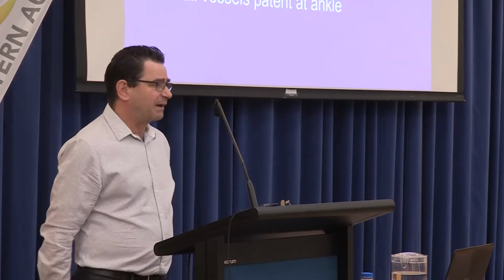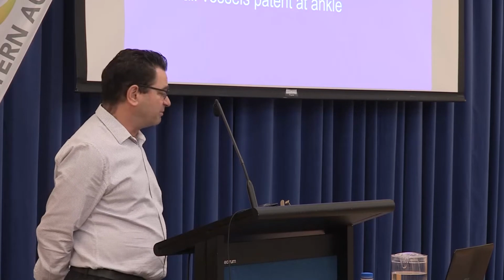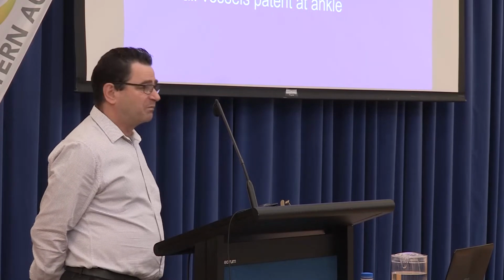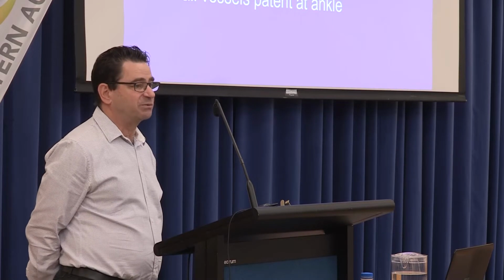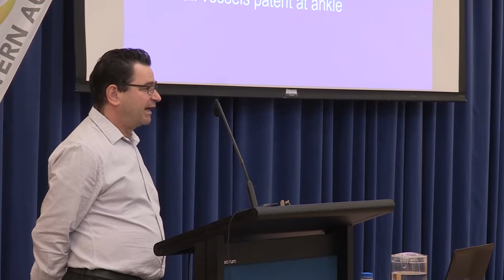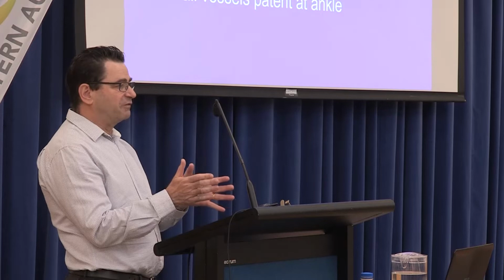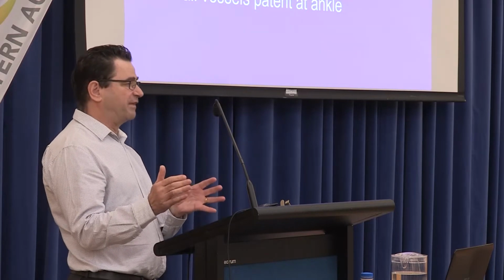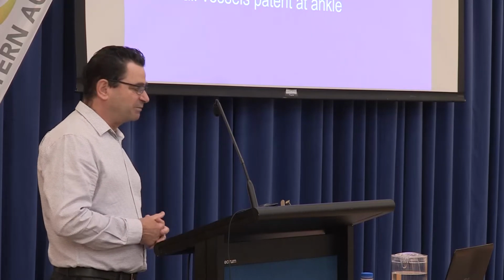So, how would I report an arterial study? It would be basically normal, plaque but no obstructive disease, a significant stenosis, which as we say is more than a 70% diameter lesion, and to put in some sort of connotation, in broad terms, if you've got a flow acceleration of 2-fold, that's about a 50% stenosis, and 3-fold, it's about a 70% stenosis.